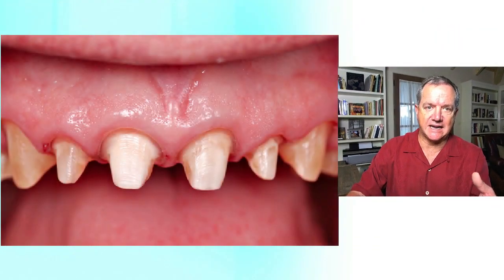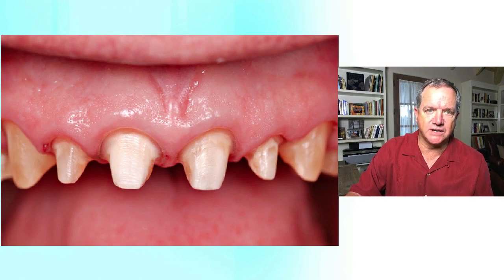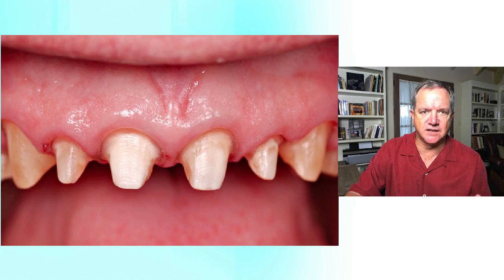Now, if you have really long preps, sometimes it's harder to get those off. And if I have really long preps, I am more likely to actually cut a notch up the facial of the temporaries and separate them. But that doesn't happen very often unless you have a patient that has some significant periodontal disease. This is what those teeth look like after that temporary came off and that one piece of cement was flecked away. Now you can either air abrade these teeth, or you can use pumice and water in a rubber cup to clean them up, and you're good to go as far as your cementation.